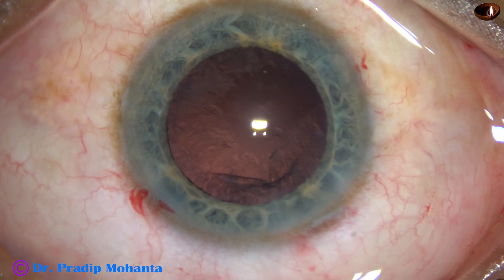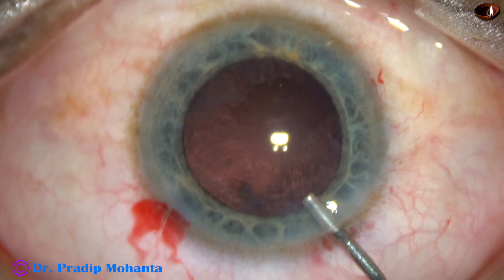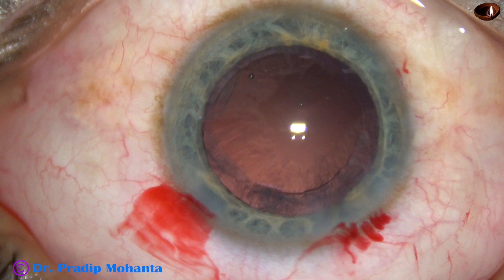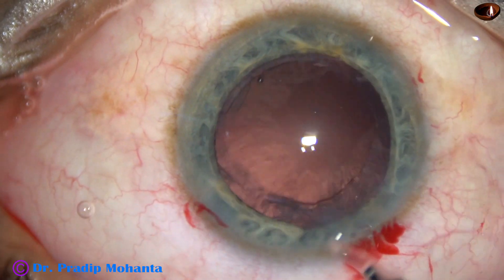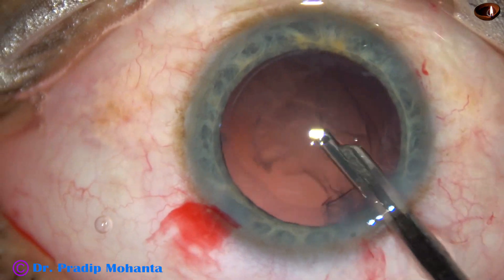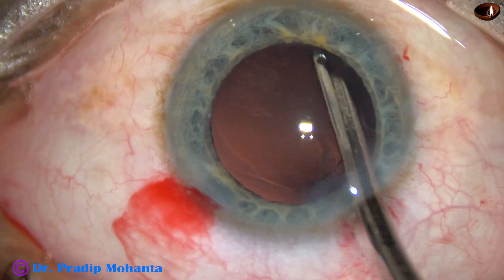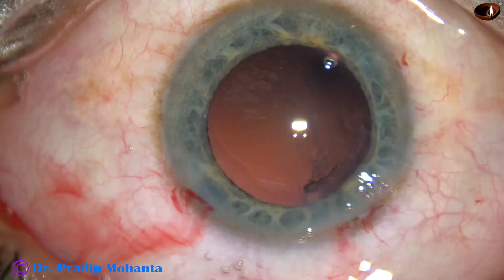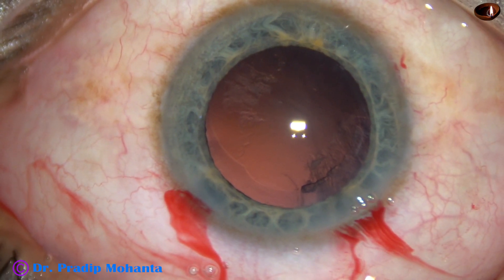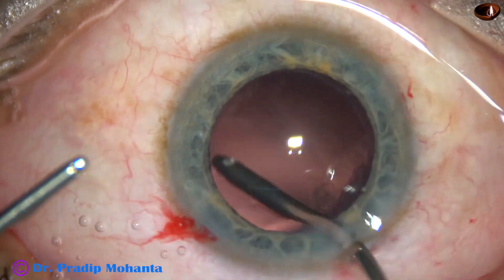And now, there is a lot of cortex. We just have to remove this cortex. I am injecting some viscoelastic in the anterior chamber. By the time my assistant gets ready with the bimanual irrigation aspiration, I take the Simcoe cannula attached to a separate BSS bottle. And now, most of the cortex except the sub-incisional cortex and the cortex at 10 o'clock is removed. Now, I take the bimanual irrigation aspiration. The irrigating probe will be used to remove the cortex sticking to the posterior capsule here near 5 o'clock.